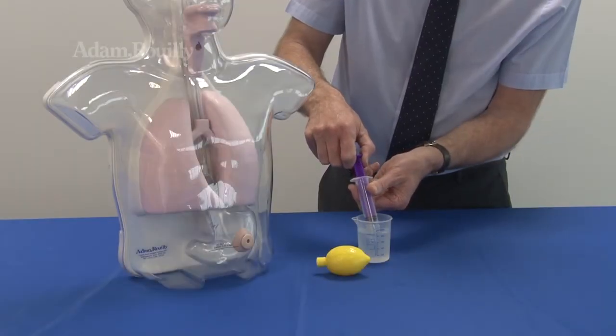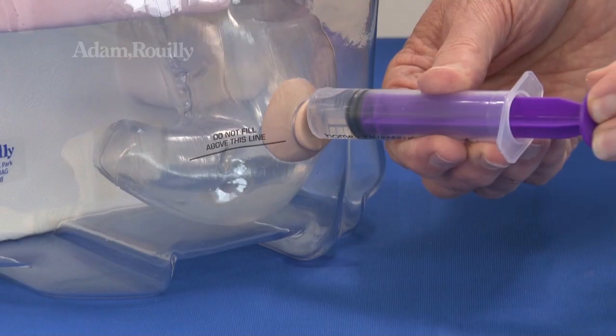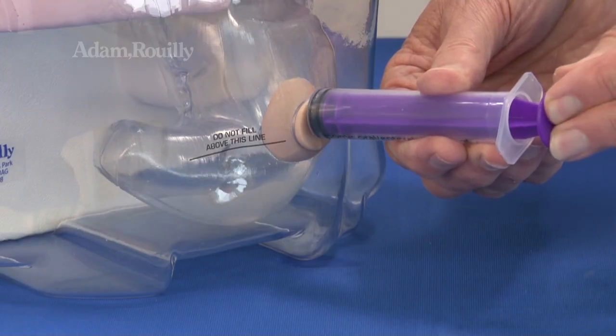Before use, mild acidic stomach aspirate may be inserted before training using the 20ml syringe and gastrostomy opening.